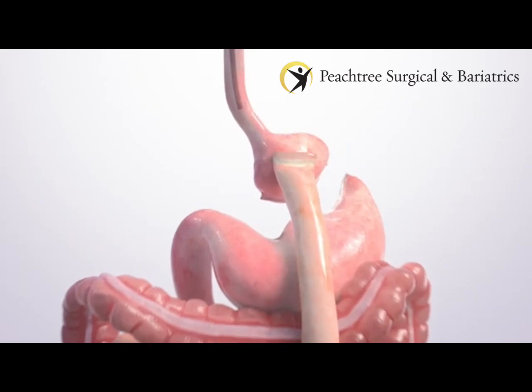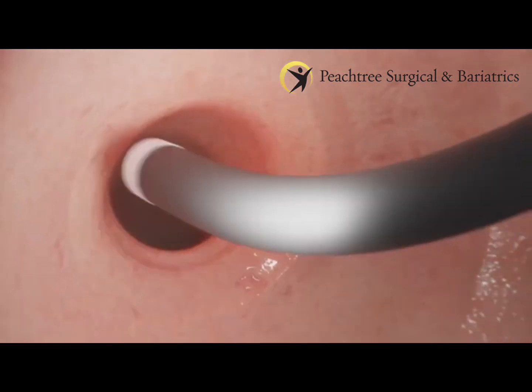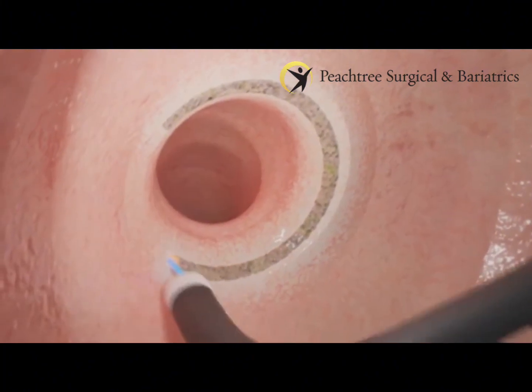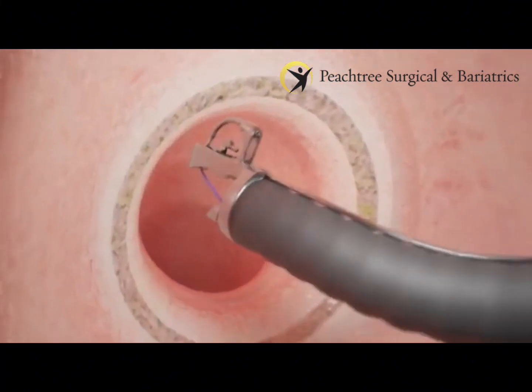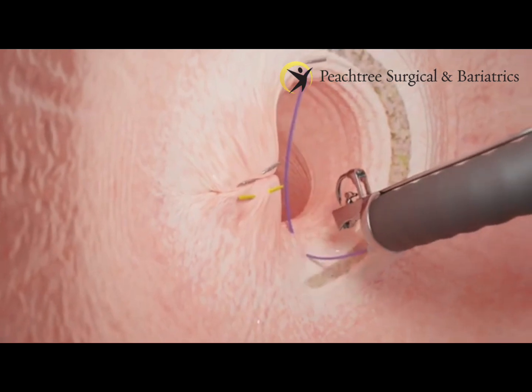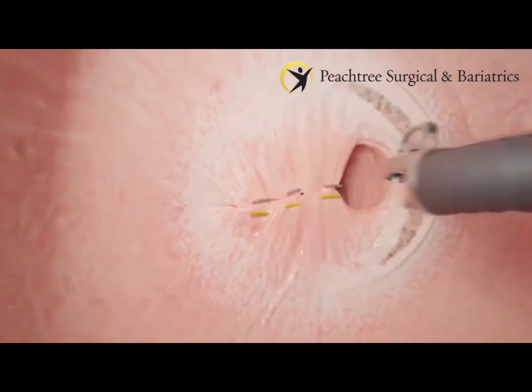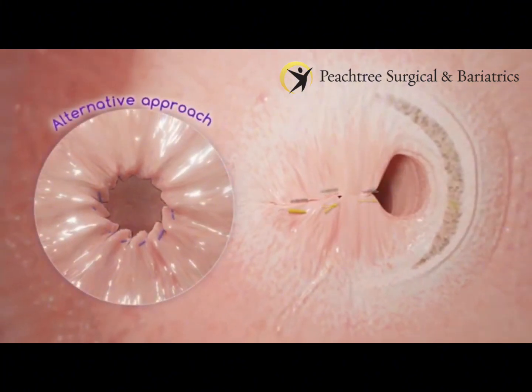While you are asleep, the doctor passes a camera through your mouth and into your stomach. After inspecting the area, the doctor prepares the tissue around the outlet to be retightened. Using the Apollo Revised System, the doctor may place a few stitches to tighten the outlet, or may sew completely around the outlet to tighten it into a smaller size.